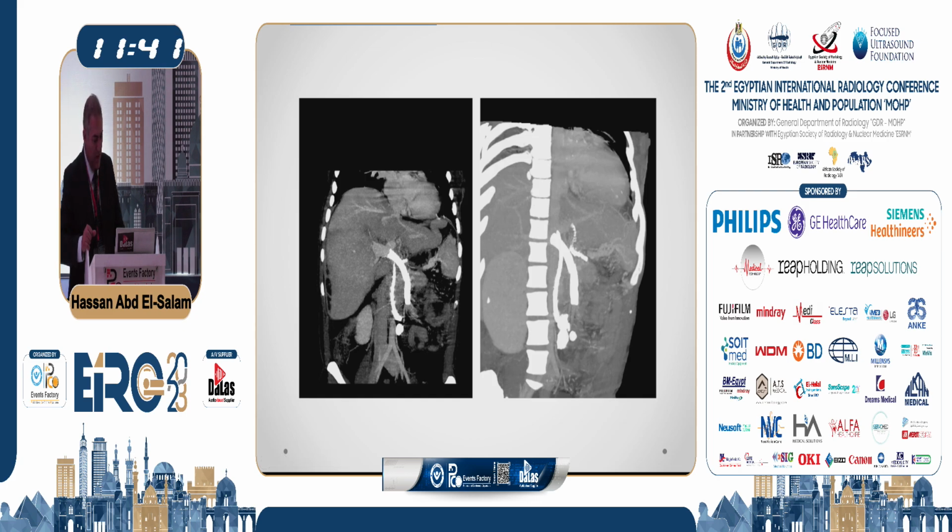This is the result. This is the plastic stent from the biliary plastic stent. This is the metallic portal stent, and these are the clips of the surgery, and you can see them very close to the portal vein and the bile duct. This lady has been on follow-up now for almost 8 years without any complications so far.